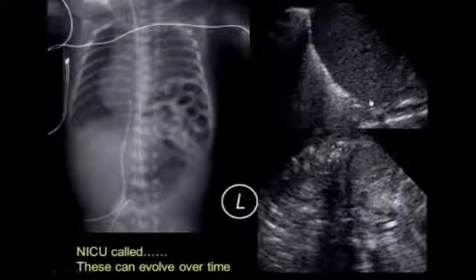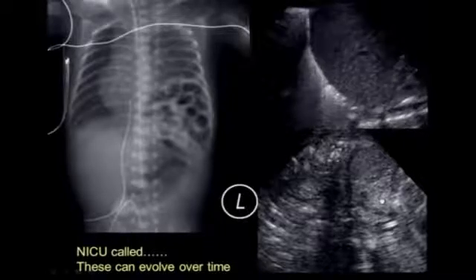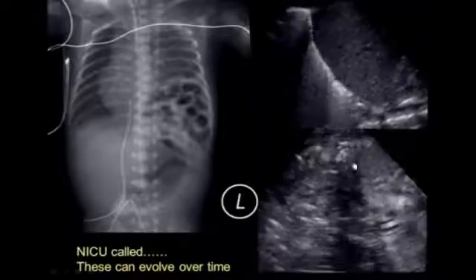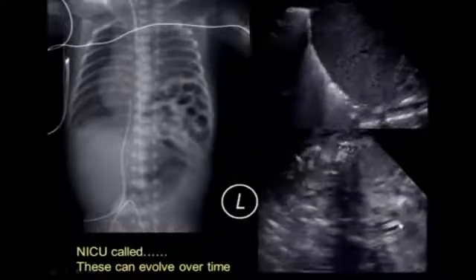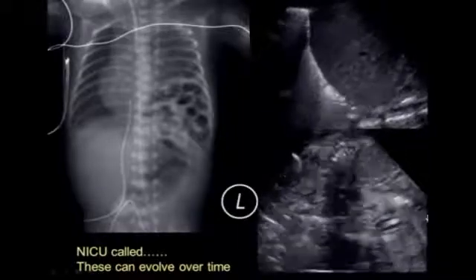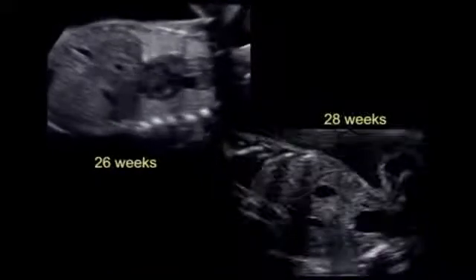We went up, and here's the right lobe, here's the liver, and you can see the nice echogenic lung. And as the child breathes, the lung moves up and down, and clearly that diaphragm on the right is beautiful. When we go over to the left side, we see that paradoxical movement. Here's the spleen here. The diaphragm should be right across here, but we see all of this complex material and the big hole right here, and here's the diaphragmatic hernia. Well, the first thing you do, and I think everybody does this, all imagers will do this, is say, well, let's go back and look at the pictures of this fetus.